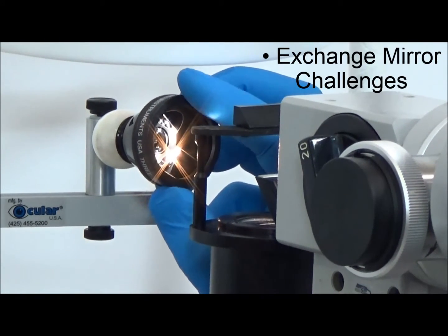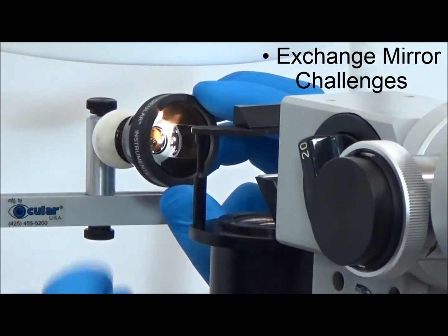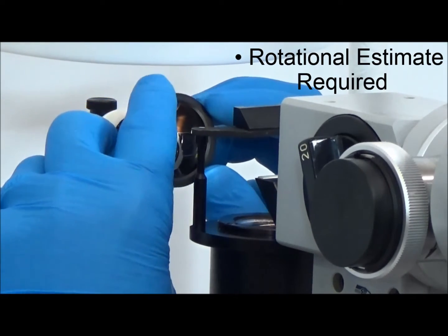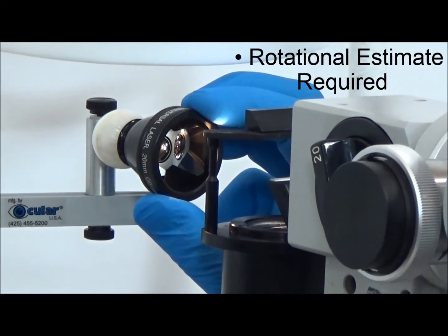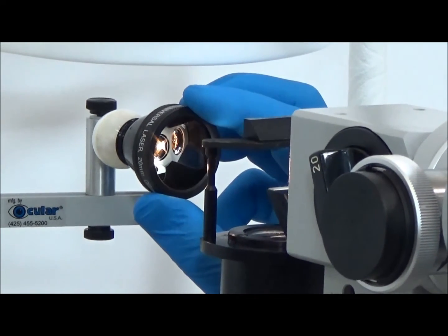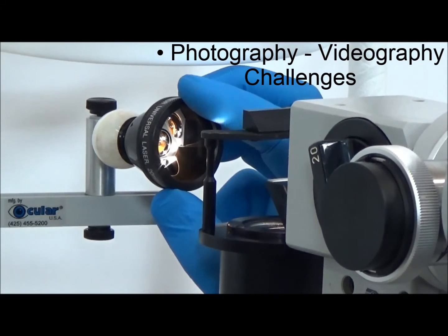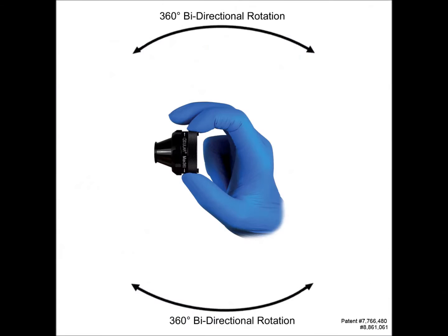When changing from one observation mirror to another, one can estimate the correct amount of rotation needed and then search for the object while viewing in the new mirror. This takes time, and there may be a lack of confidence in the new lens position. This process is further complicated during photography and videography, as a free hand is not available to control these devices.